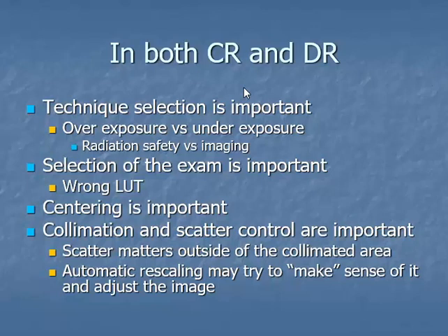technologists in the early implementation of CR had a tendency to make exposures with too much technique in order to prevent having too little technique and underexposing the patient. Underexposure might have meant a repeat, whereas overexposure meant you could just process that out. That led to an ethical problem that we had to face, and it was called dose creep. People got lazy, they got unprofessional, and instead of learning their techniques, they just shot everybody with way too much radiation.